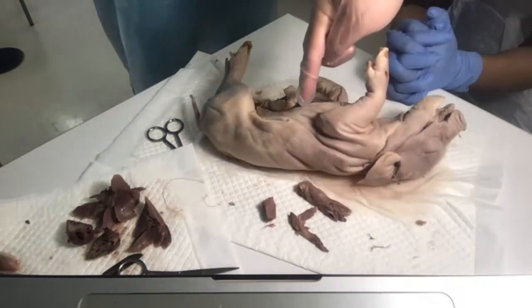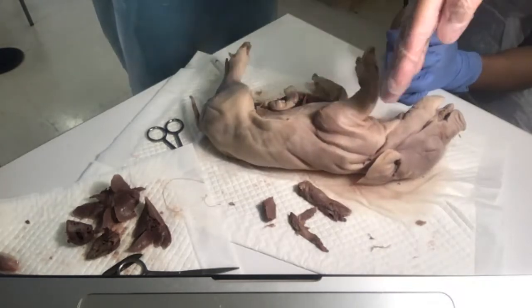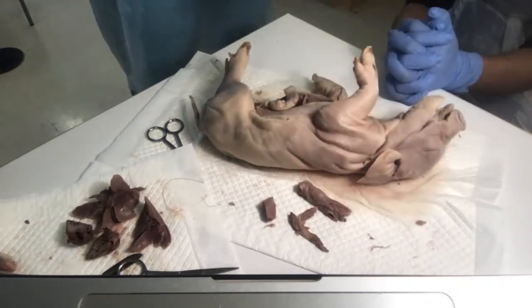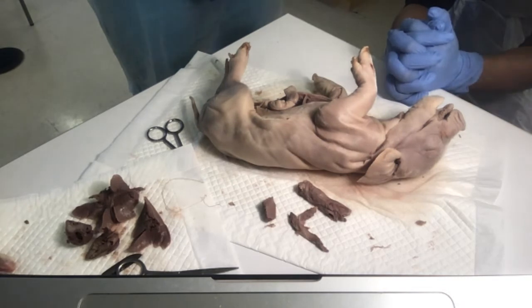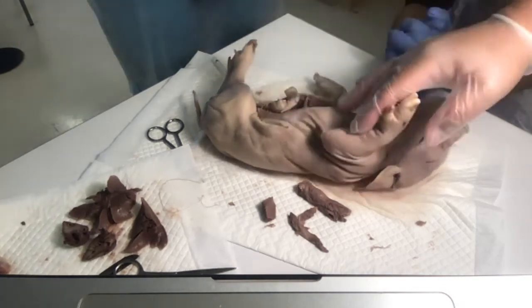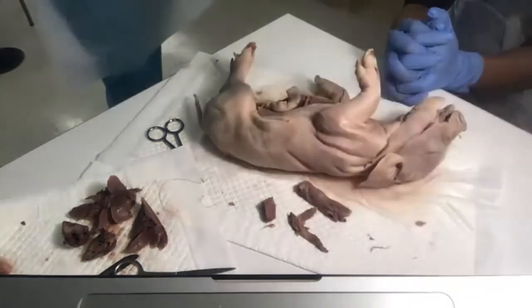And then I want you guys to make a tape on the top, I mean the top and the sides, but let the bottom open so that when my patient exhales, the flap goes out, when they inhale, the flap goes in, and keeps a seal. It's good enough to get to the ER, right? And nowadays, the packs that we have seal on only three sides when we're dealing with something like a sucking chest wound.